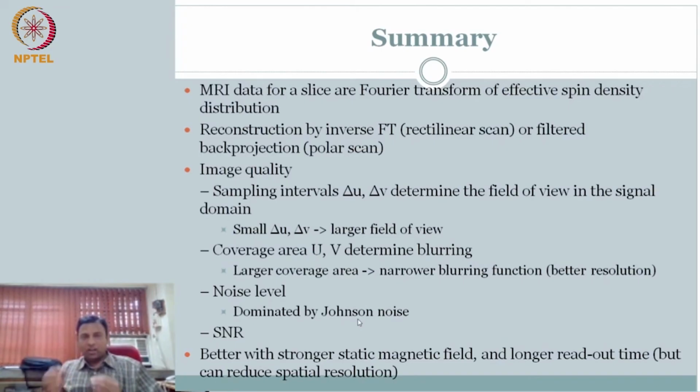If you look at an image, I hope you will close your eyes, at least this exercise I would like for you to do, and see: I know how to interpret what this white means, what this black means, what this gray means. I know its units. I know the physics of the signal, and I know what instrumentation dictates the limits of our interpretation of the signal. I think that you should do it for each modality.